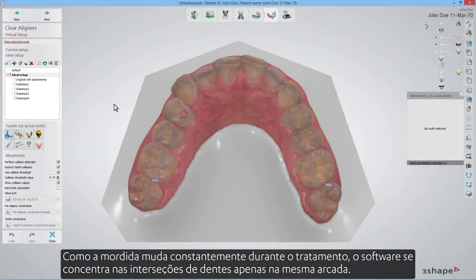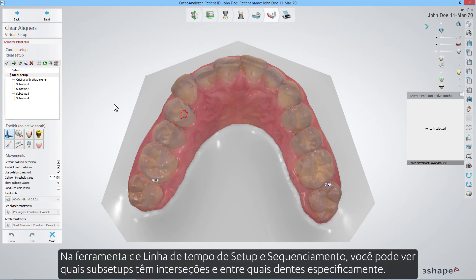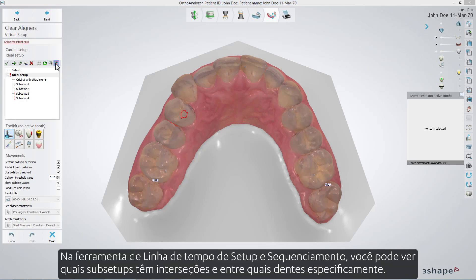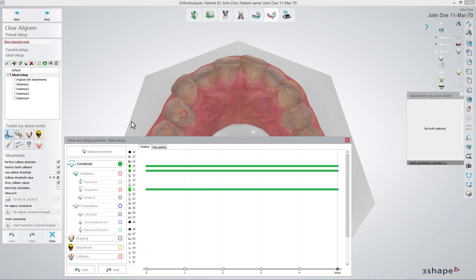As the bite changes constantly during the treatment, the software focuses on the intersections within teeth only on the same jaw. In the setup and staging timeline tool, you are able to see which sub-setups have intersections, and between which teeth specifically.